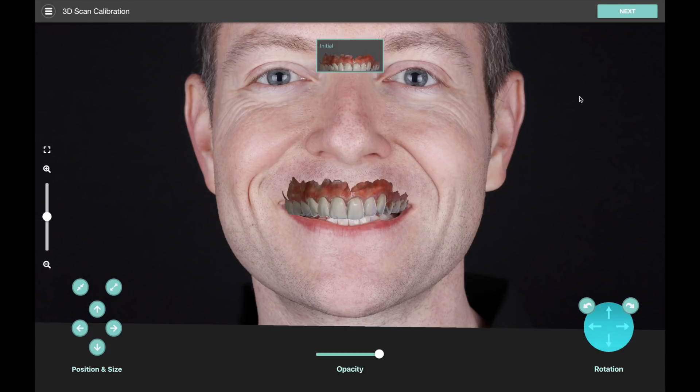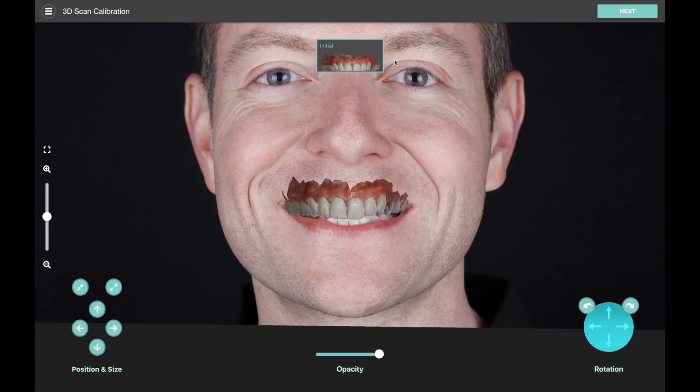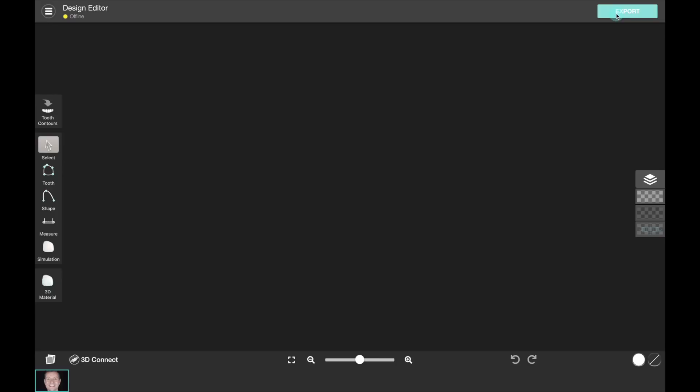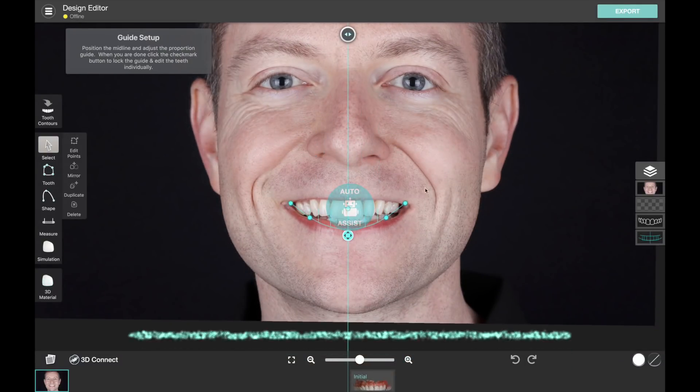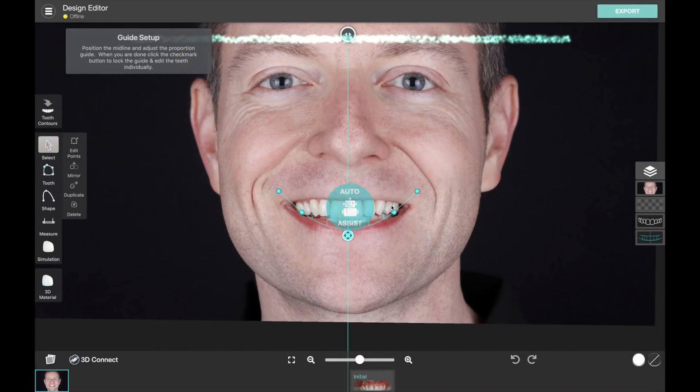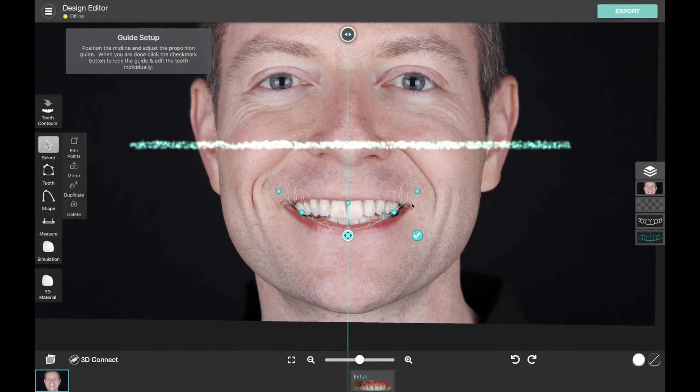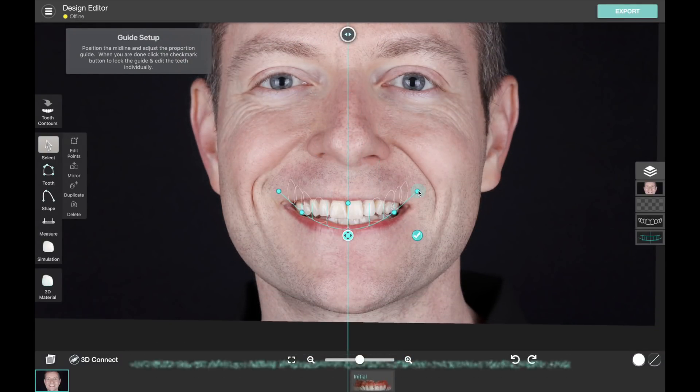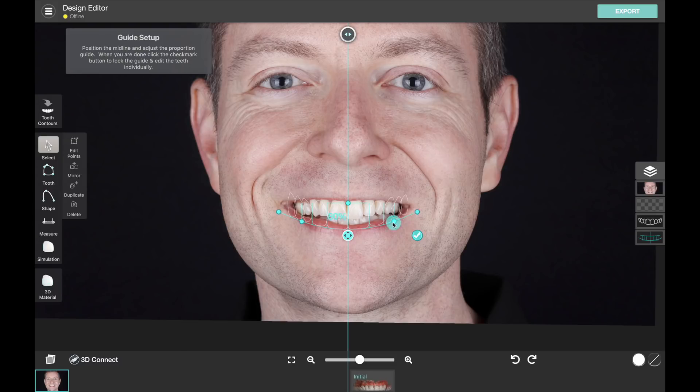So once we've done that, we're ready to go to the next step. Now if you bring in other model files, you can match them up as well or just use the same orientation as the initial scan. This 3D support is really useful for doing quality control and also for showing the patient different steps of the process as you go along.